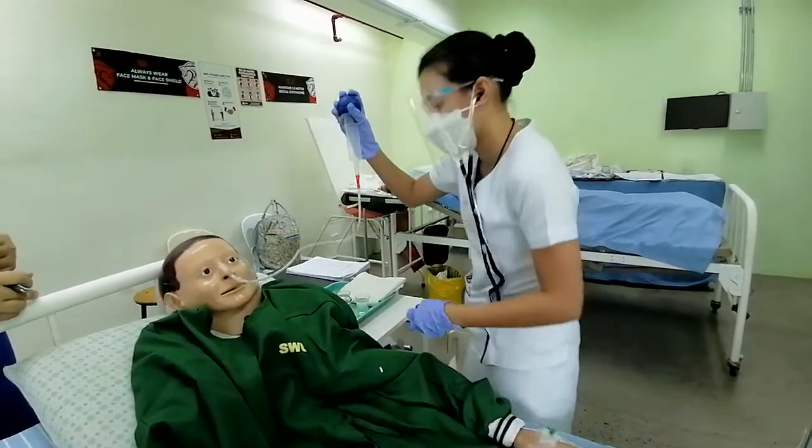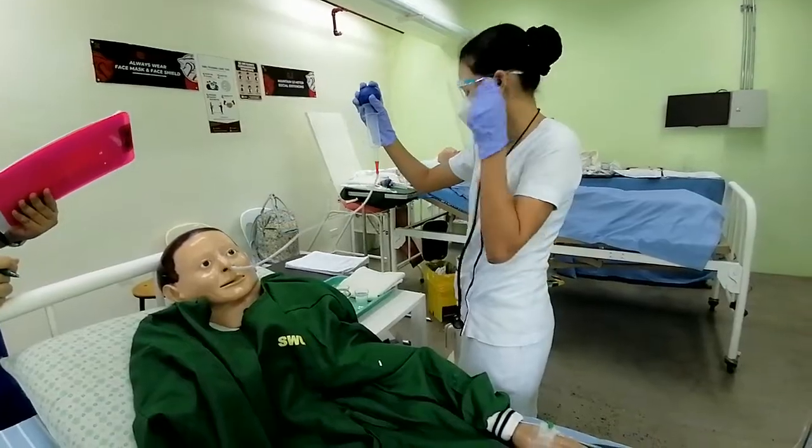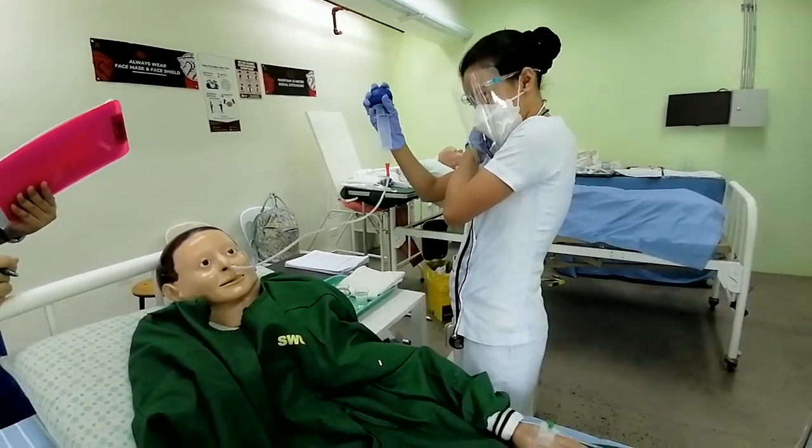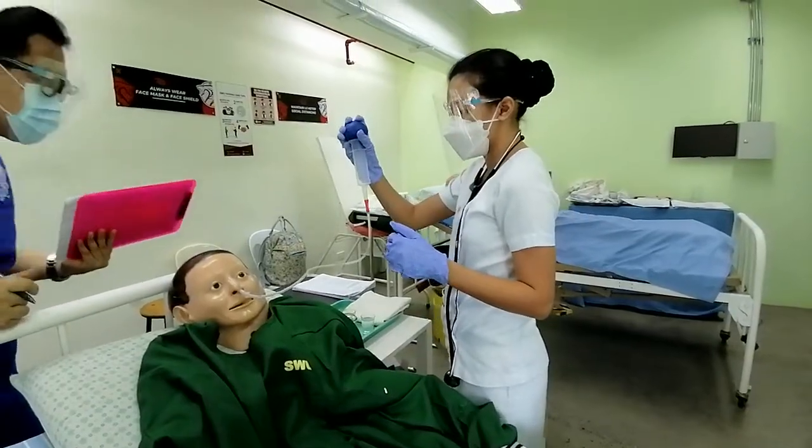So there's a gurgling sound. After which I will check for the gastric residual.